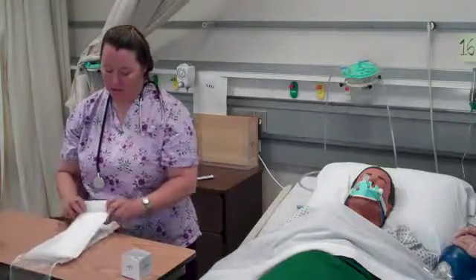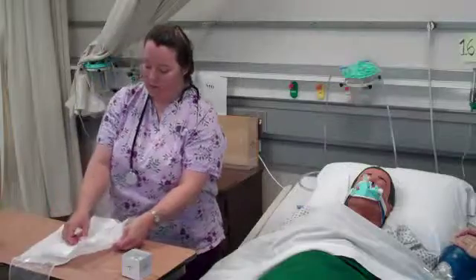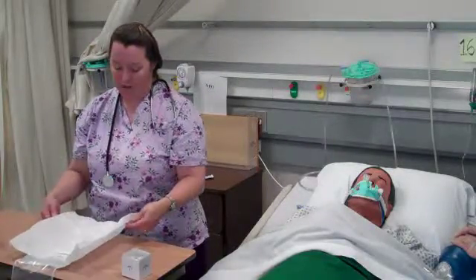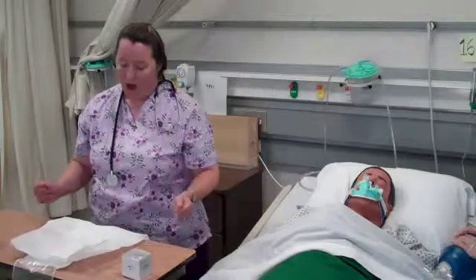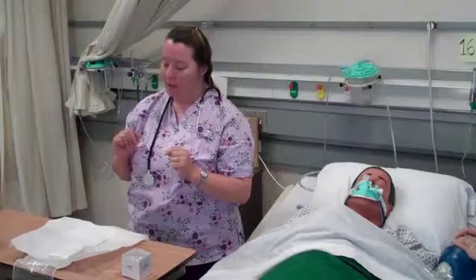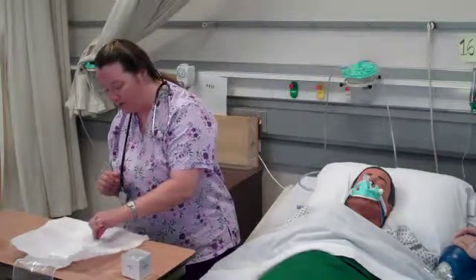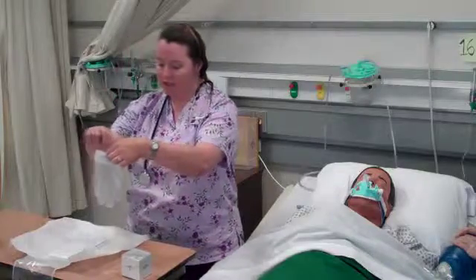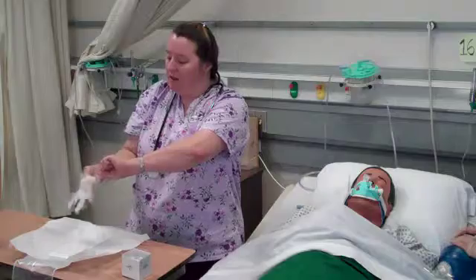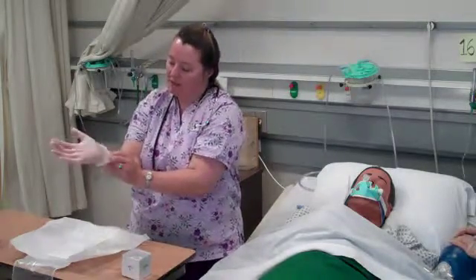Again, I'm going to uncrimp those edges so it doesn't pop back on me. I'm going to make sure I'm only touching that outer inch to support the sterility of the equipment that's inside here. These gloves inside are sterile. They are not labeled right or left, but I am going to glove my dominant hand first. I'm going to reach down and only touch that cuff part that's going to be touching my skin. And I can glove my dominant hand first, again touching only the part that's going to be touching my skin.